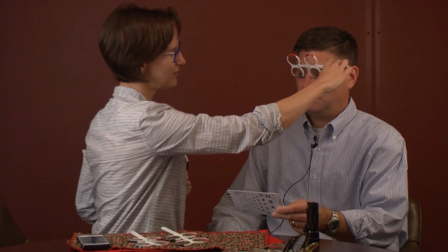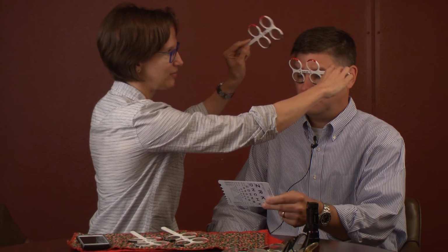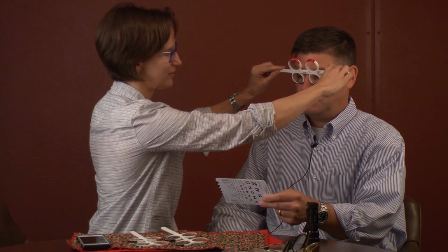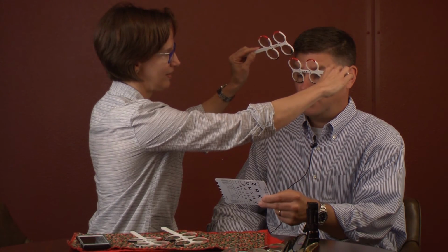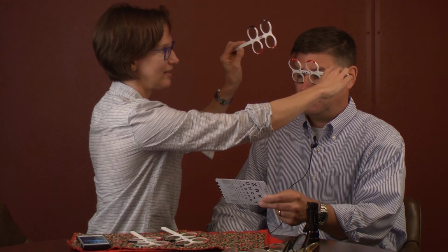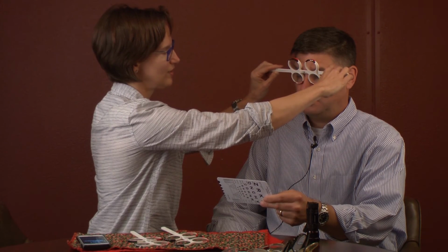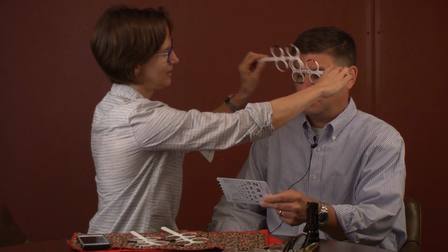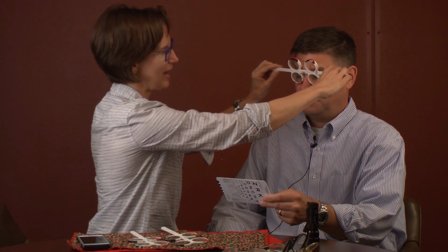And we'll stay at that 3, but we'll go up a 0.5 by adding the black 0.5 to the black 3. That gives us a total of 3.5. Is it better with 2 or better with 1? With 1. Then I'm going to flip it to the other side. Now we've got the negative 0.5. We'll add that to the 3. That gives us a 2.5. Is it better with or without? With. So that lands us at about 2.5.